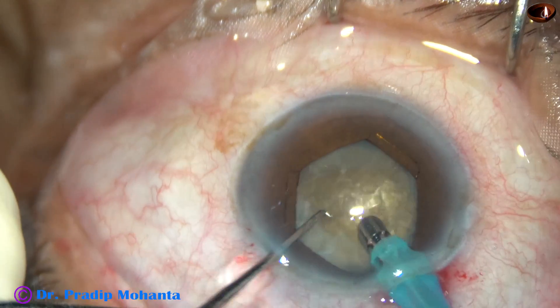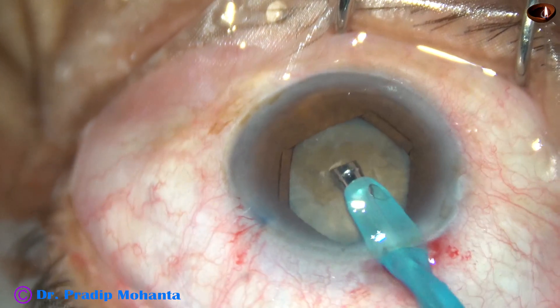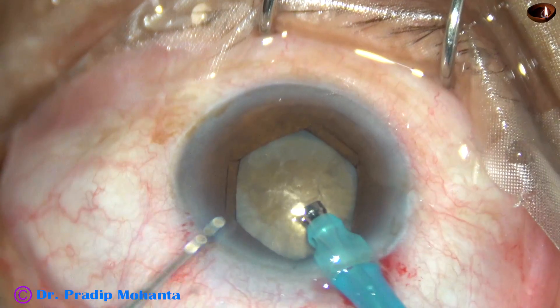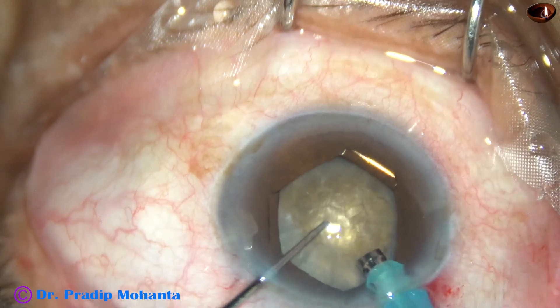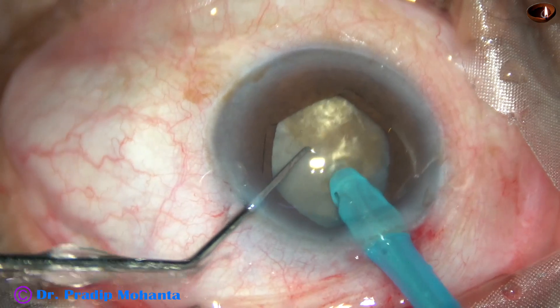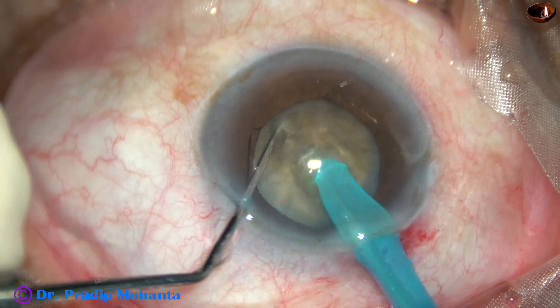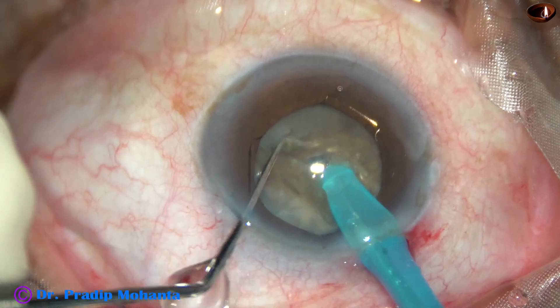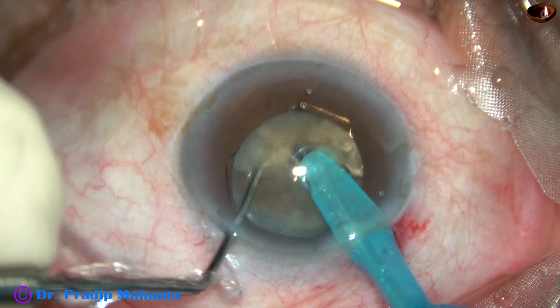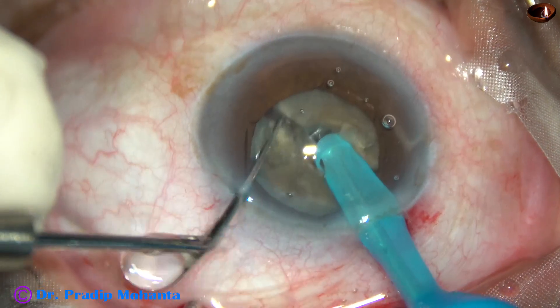And watch submarine chop for this hard cataract. By the chopper, the nucleus is pushed a little down and the tip of the phaco needle is buried into the substance of the nucleus just in front of the main incision. It goes through the nucleus near the opposite equator. As it crosses the center and reaches the midpoint between the center and the opposite equator, the chopper is used to divide the nucleus.